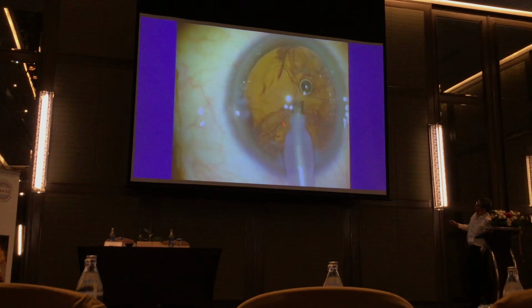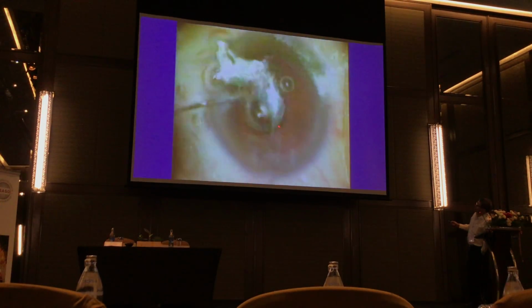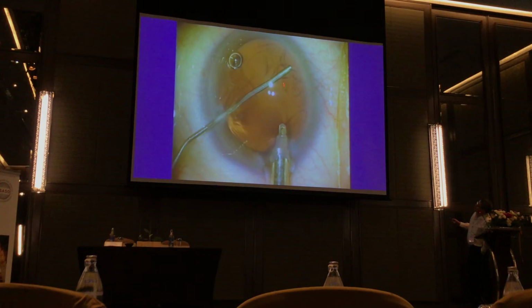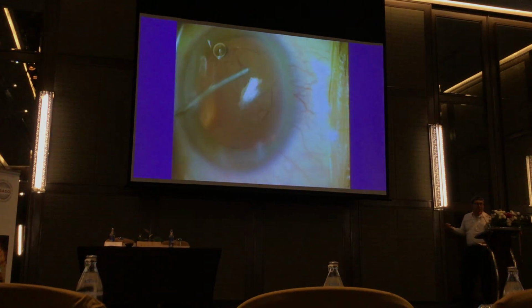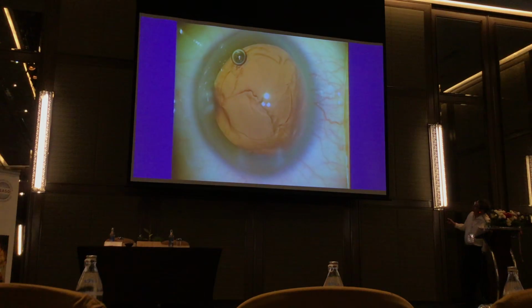So here's what I often do, and I'll do it in these tricky cases. Inject air. Air is free, right? You pull it out, and then just before finishing IA, I will inject Provis here, just deepen it enough, and then you can remove it without the dramatic shallowing of the chamber. Then you can top it up a little bit.